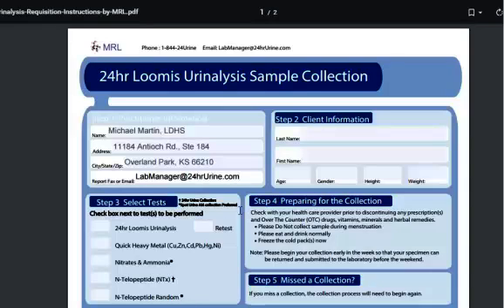All right, so over here we're going to have the client. This is the last name of our client. First name, age, gender, height, and weight.